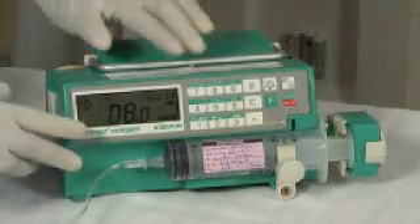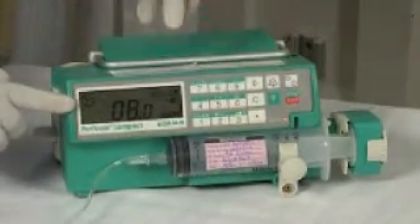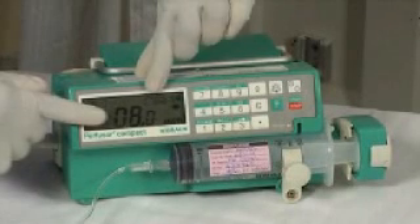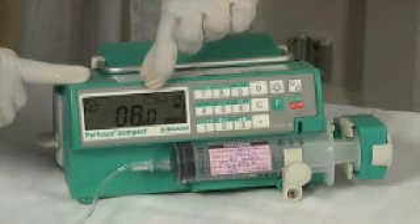Changing the empty syringe. The alarm is beeping and the symbol of the empty syringe is flashing on the display. This shows that the syringe is empty now and needs to be replaced by a full one.